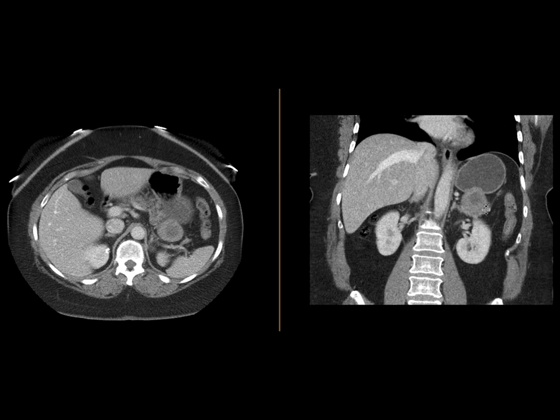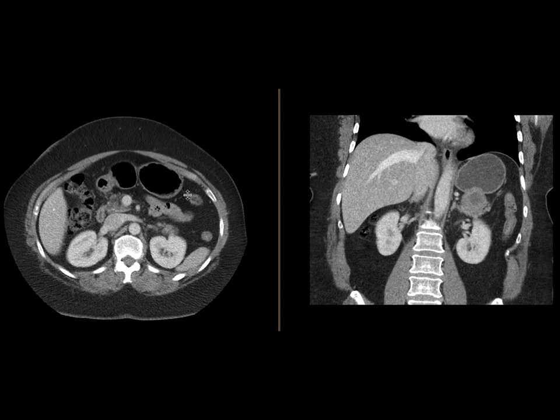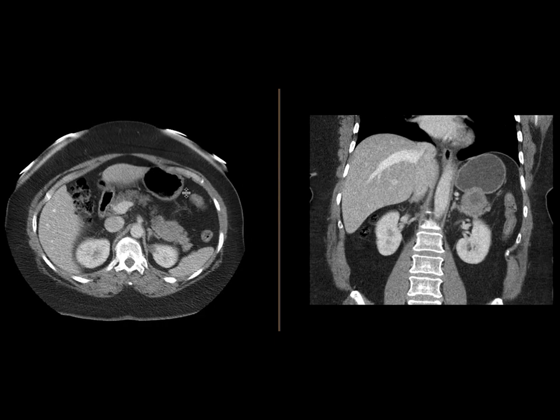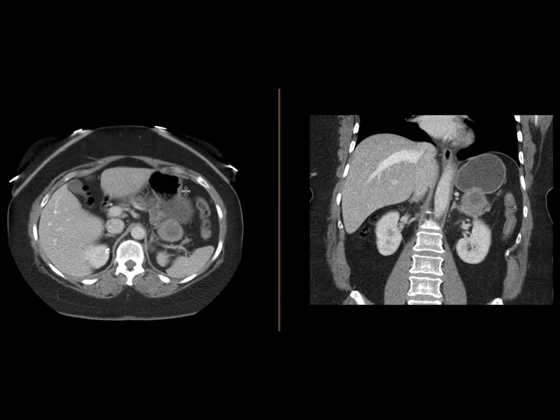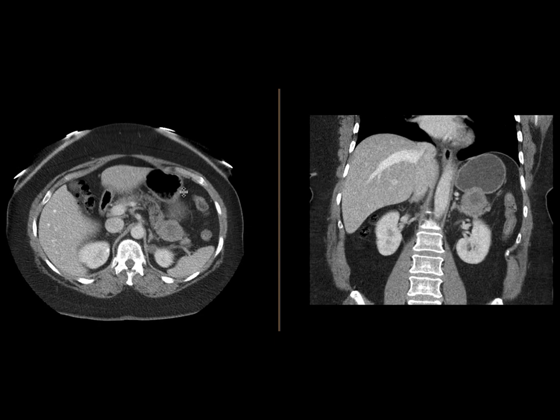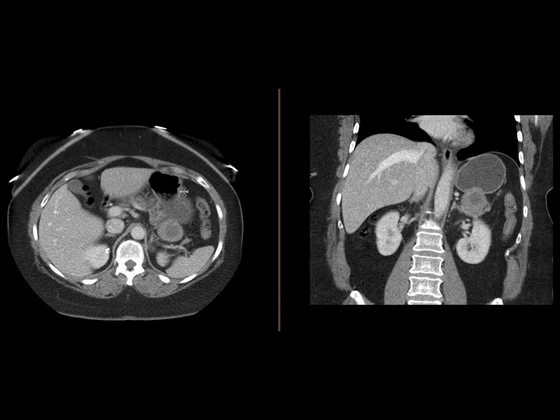Lymphoma may be another possibility, but again this would be atypical for lymphoma. This particular mass is very heterogeneous, and lymphomas usually have a more homogenous attenuation prior to treatment. In addition, lymphoma also typically manifests as a region of gastric wall thickening rather than a discrete exophytic mass. Lymphoma is also typically associated with adenopathy, which we don't see in this case.